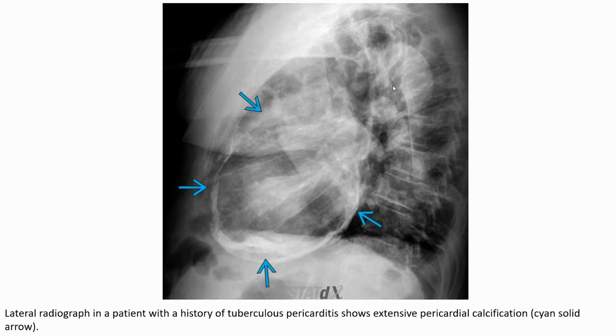The lateral radiograph in a patient with a history of pericarditis shows extensive pericardial calcification.